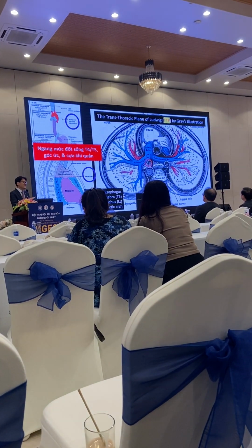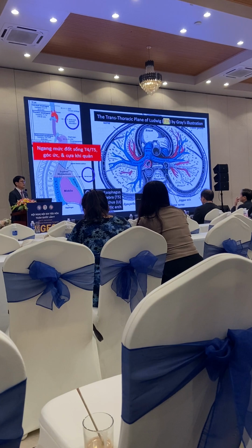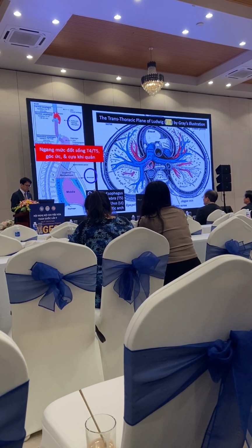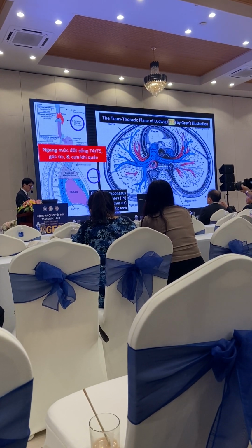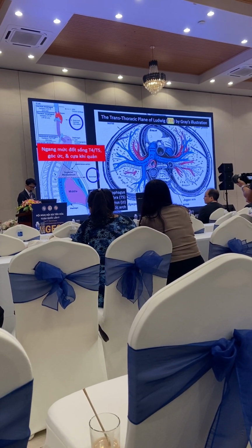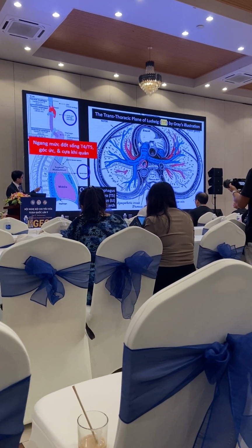And then I would like to talk about the transthoracic plane, which we usually call Ludwig's plane, with illustrations. This is a very important and interesting picture. Right, I cannot see it, but it's okay.